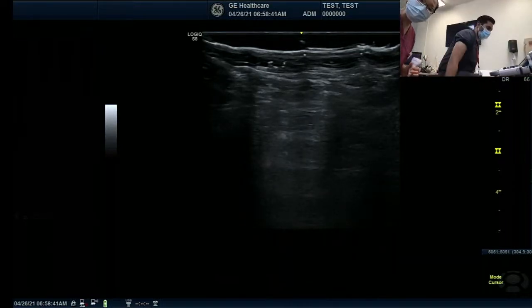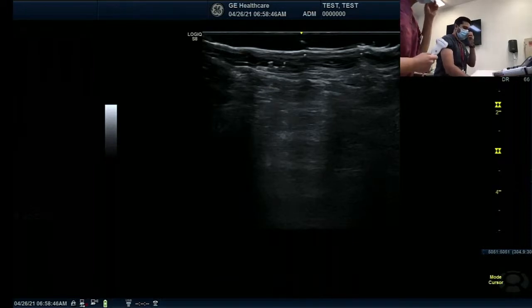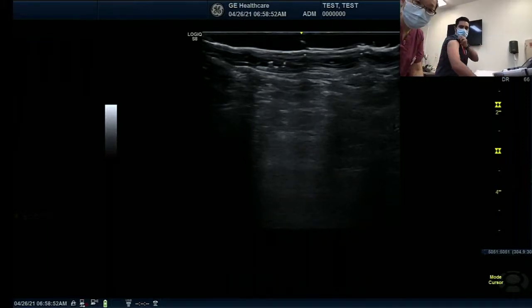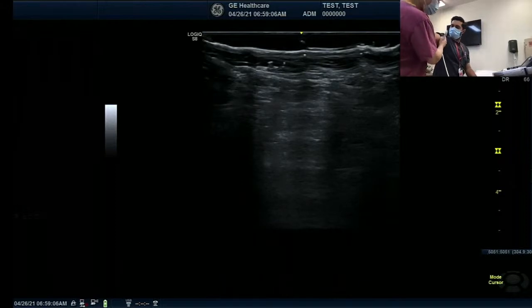We're going to go over the radial nerve one more time. Today we changed the room, since we're going to do the lower limb, we moved to the examination room. I uploaded the radial nerve since last night, so you can review my PowerPoint slides. But we will start with the axilla. I don't need to go to the axillary area. So this is the axilla.